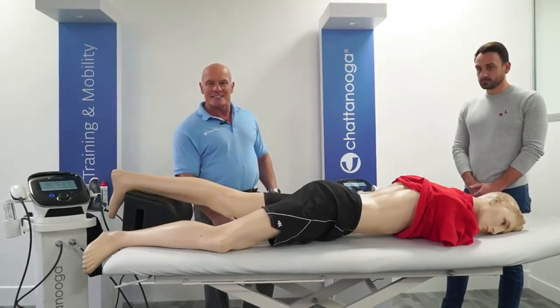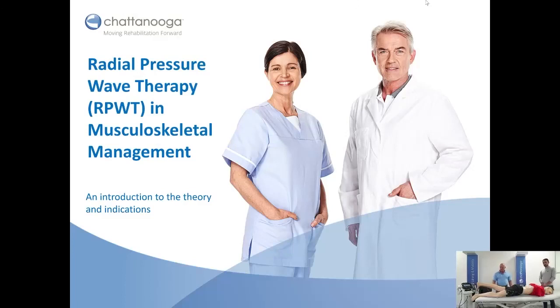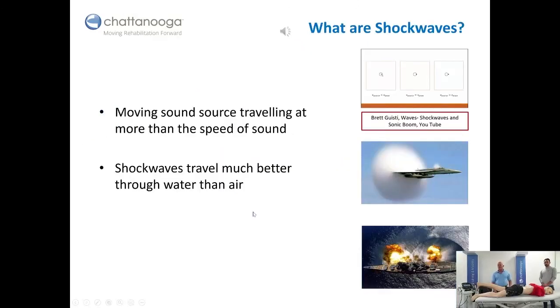Okay, so let's get started. We can have the next slide. Okay, so we're going to start with what is a shockwave. There we go. I thought I'd wake everybody up by starting with that. So how is a shockwave produced?